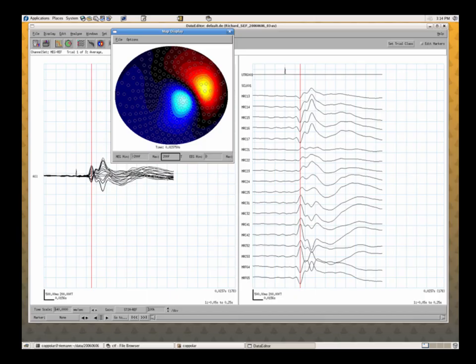And then this is a similar example. This is now a median nerve stimulation, a punctate electrical signal to the median nerve. There are a number of different pieces to this. This is the N20 component, or actually in this case we call it M20 because it's the magnetic field. We don't differentiate between negative and positive because the flux going in and out is not quite the same thing as a negative signal on the brain.